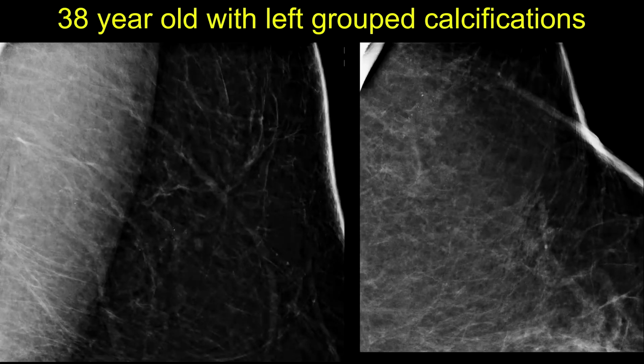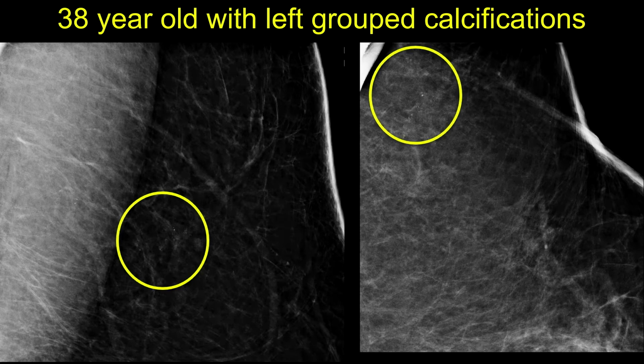When does the arm through the hole fail? When you have a patient with a very large breast and a very broad shoulder, and you cannot fit both structures through the hole of the table opening. We have a patient like that here. So here is that posterior lateral tissue that we cannot reach with the other methods. In this situation, your only option is probably to biopsy this with the upright unit.